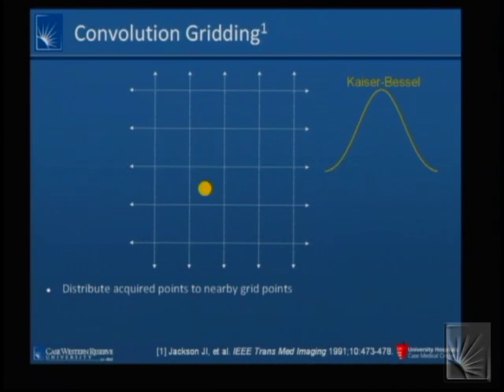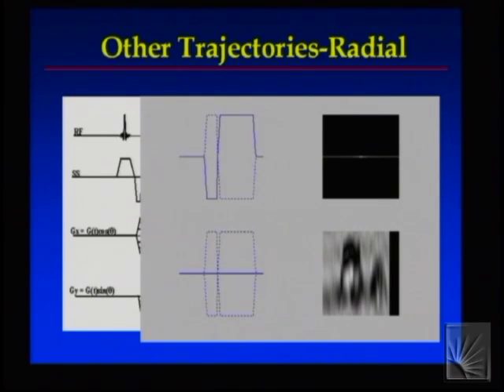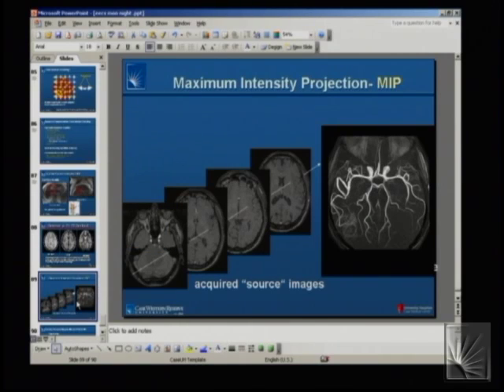Even the stuff I was showing here, for example, with the MR angiographic images and maximum intensity projections, is another example. We can set up the acquisition so that the areas with blood flow are brighter than normal tissue. What we then need is algorithms that go through that data set and project it onto a given orientation. We're good at acquiring the data and reconstructing the images in some cases, but then there are all kinds of applications like this.